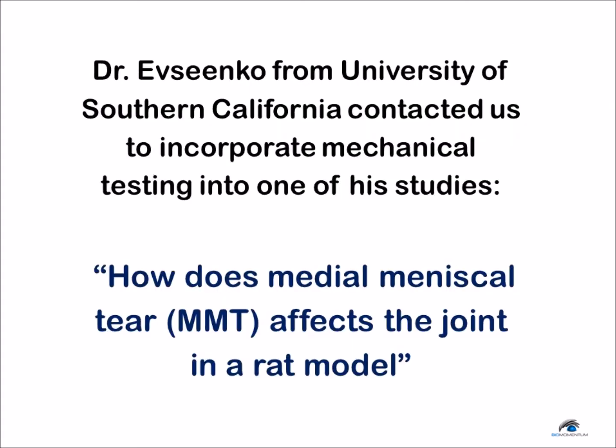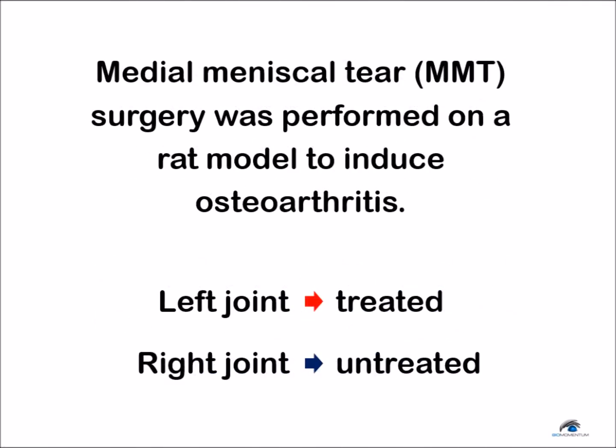Dr. Evseenko from University of Southern California contacted us to incorporate mechanical testing into one of his studies. How does medial meniscal tear affect the joint in a rat model? Therefore, a medial meniscal tear surgery was performed on a rat model to induce osteoarthritis.